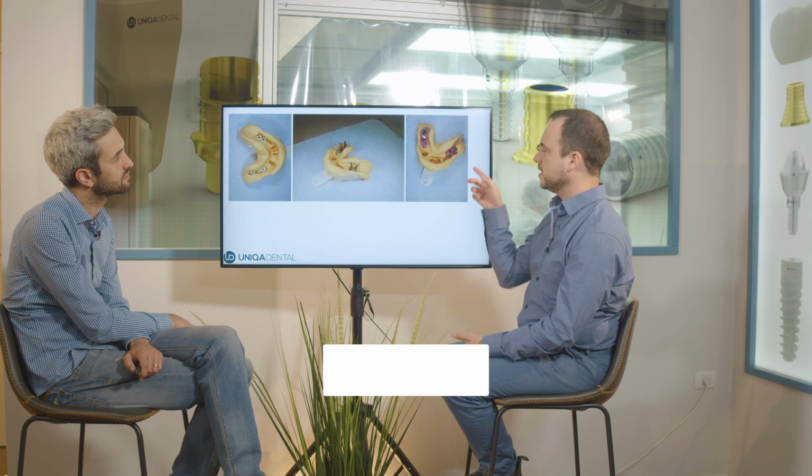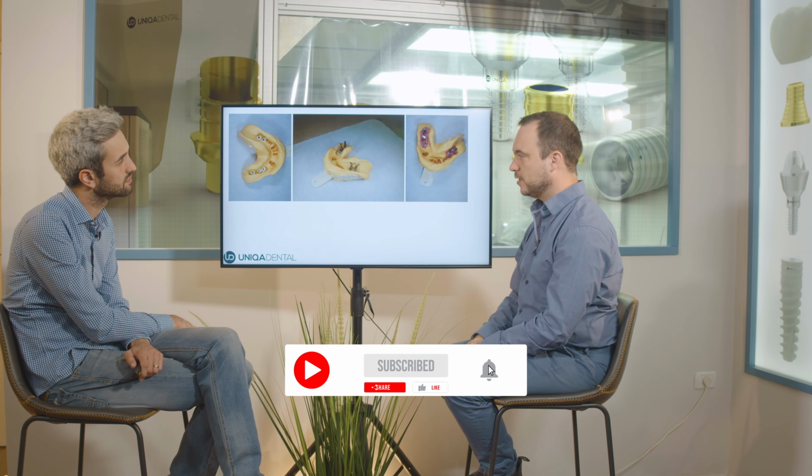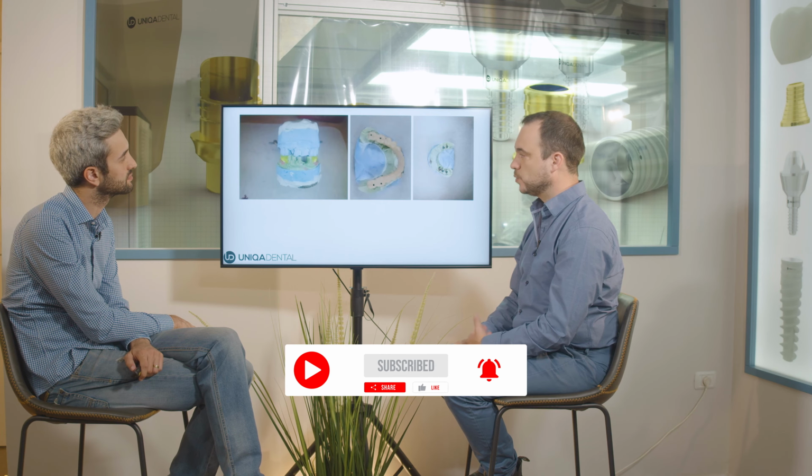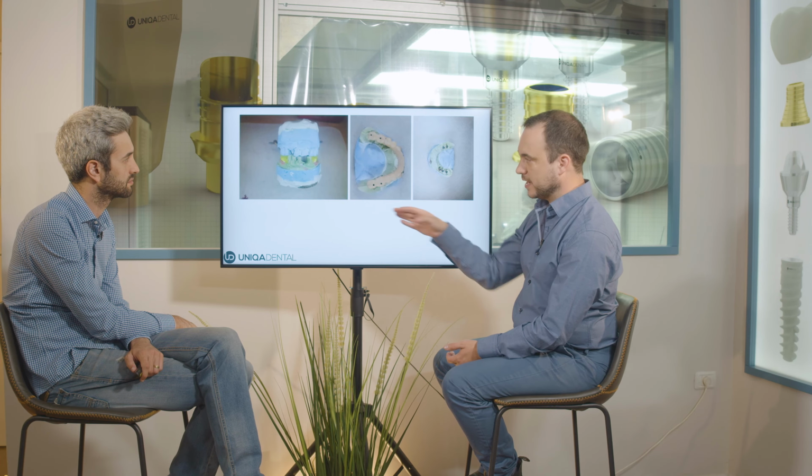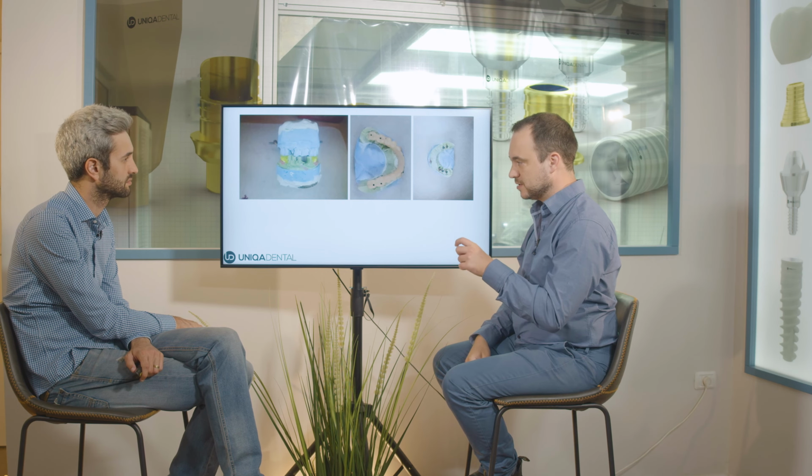After that, we put some silicone for the gingiva in the model, and we poured the gypsum and made a model. Here you can see that the composite material on the transfers can show us the vertical dimension. In this model, we can cut the teeth and still have the vertical dimension that we wanted. We know the vertical dimension because we took the impression with composite material at the vertical dimension that we chose, and we don't need any reference to those teeth.